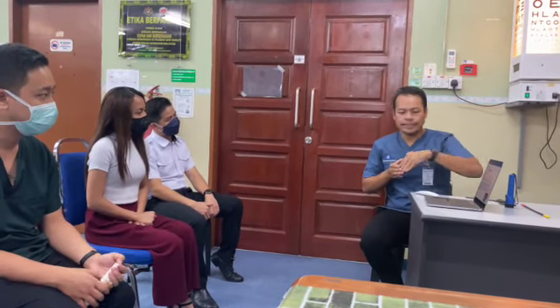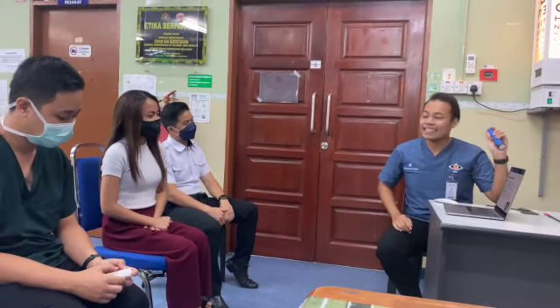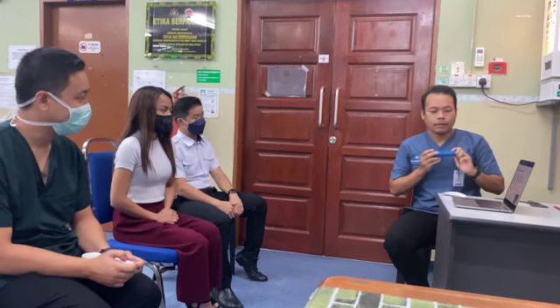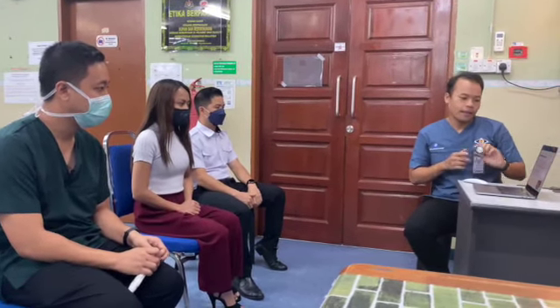And then the next is the pinhole occluder, and then the distance. You need to measure the distance of about 6 meters for the first time, and the last is the torchlight. We need this when the patient is unable to read the Snellen chart from 1 foot.